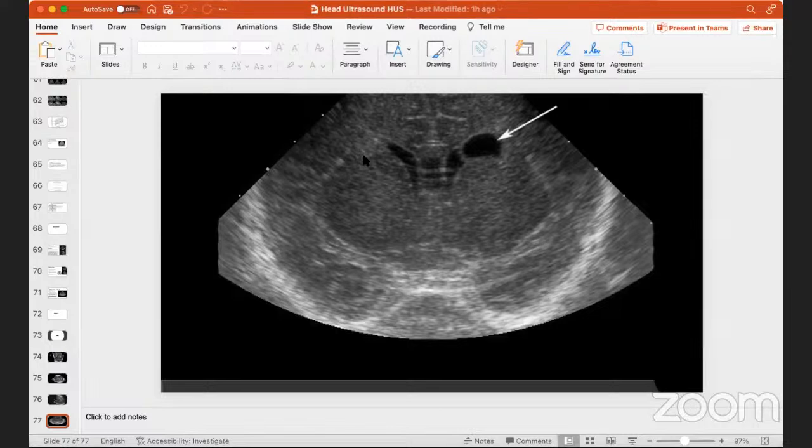One is about the color Doppler and color pattern on any structure. It depends on the orientation of your probe, and on the schematic that you have shown on the right side.